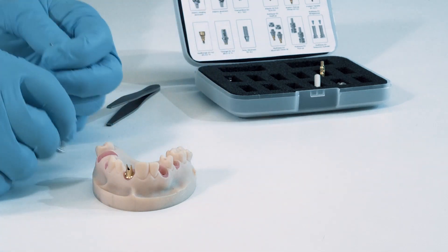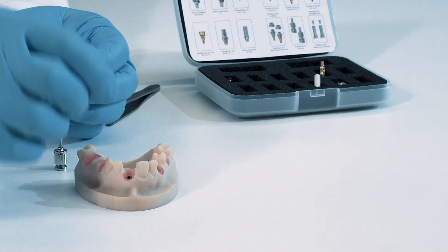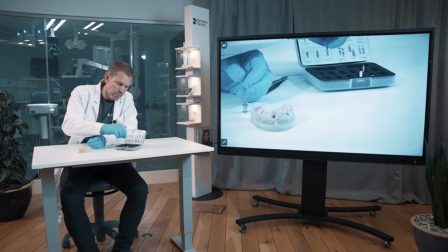First comes the screw, then you take out the abutment and put them back in the box.